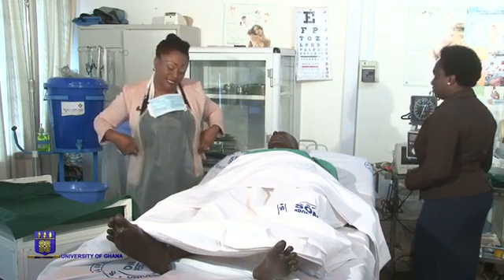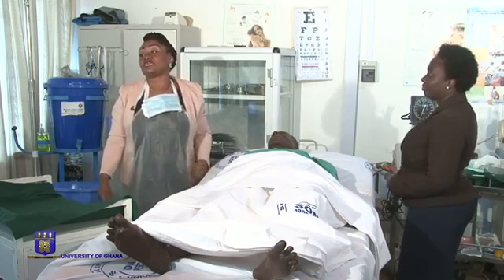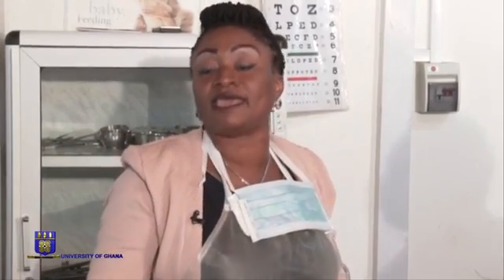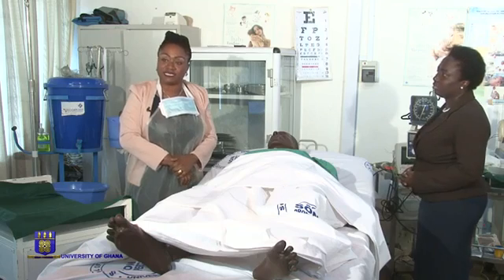Now the nurse is supposed to wear a rubber apron to protect the uniform as well as the mask. The mask is worn throughout the entire procedure in preparing the trolley and then carrying out the procedure.